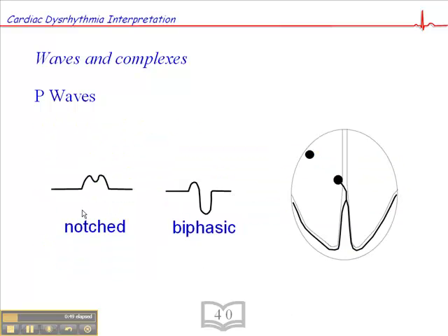So let me give you an example. So here is an example of a notched P-Wave, and here's an example of a biphasic P-Wave.